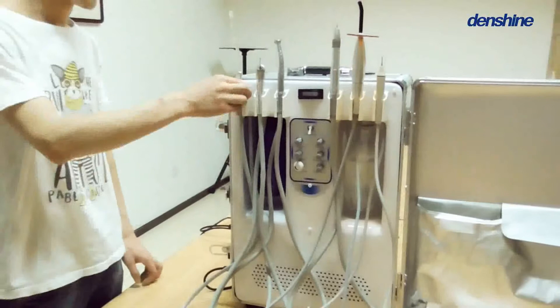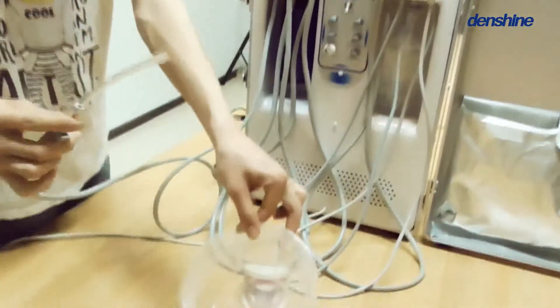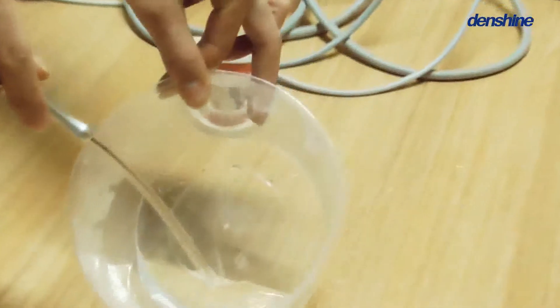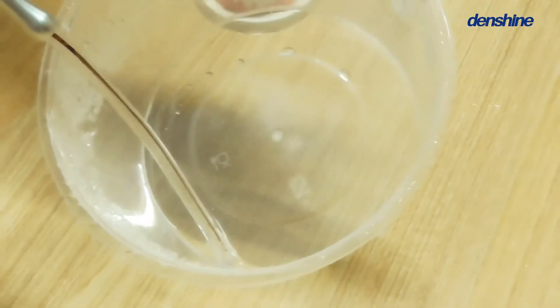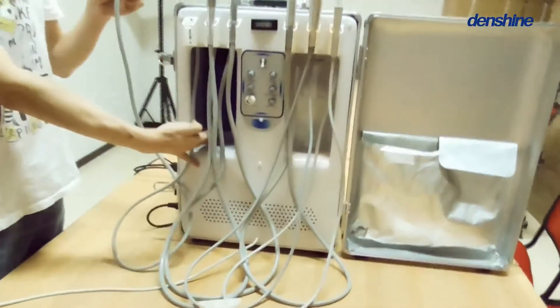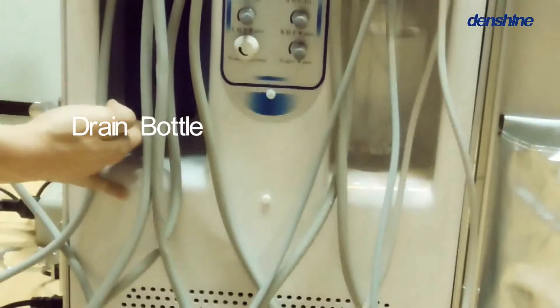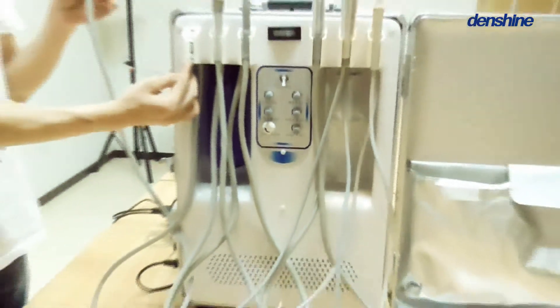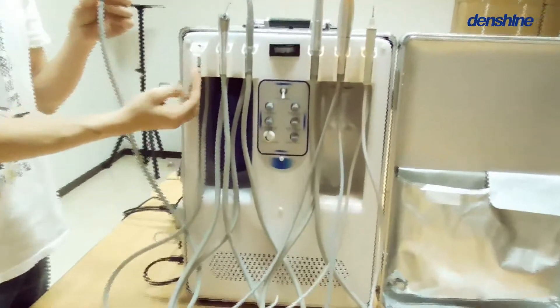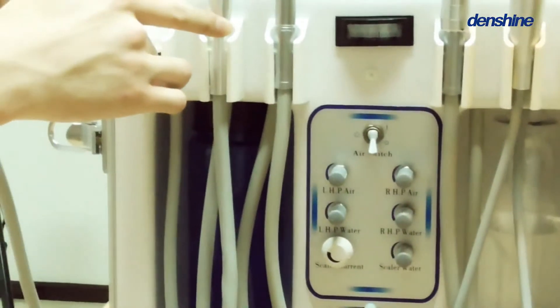Firstly, the saliva ejector. Take it down and demonstrate by the water. The water will be absorbed into this draining bottle. There is an inductor here which controls the on and off of the ejector, as is shown.